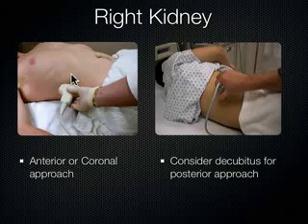From the coronal view, you can drag the probe up anteriorly, and then you're going to tilt the cable towards the ceiling. By doing that, you're fanning the probe, shooting the sound more posteriorly. And actually, many times, that anterior approach, using the liver or the spleen as your window to see into the kidney, is actually a better way to go than even a coronal view. Every patient's different here. This is the art of sonography we're dabbling in right now. Did you have a question?